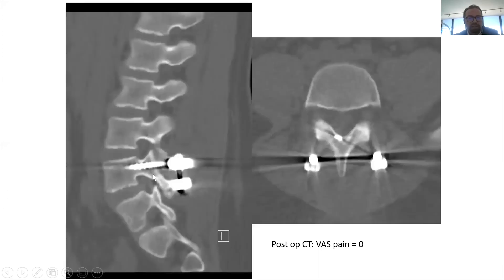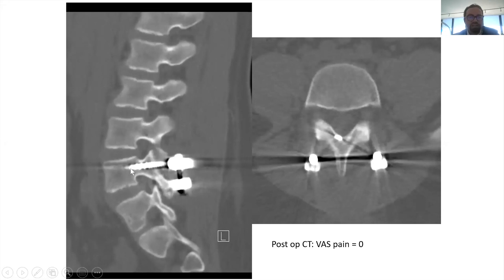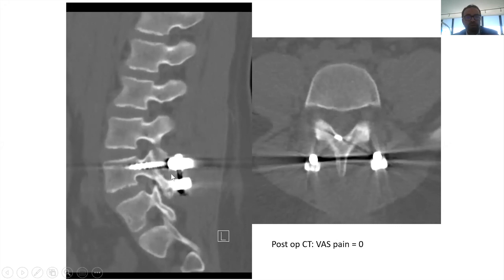On a follow-up CT scan you can see that it has healed. You don't need to remove the hardware because you did not perform a segmental fusion — you did not fuse one vertebra to the other. His flexibility in the spine is unchanged compared to before surgery, following the pars repair, also called osteosynthesis.